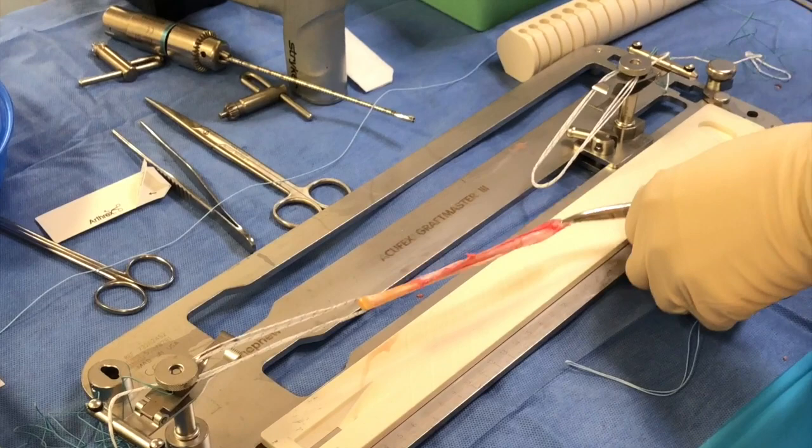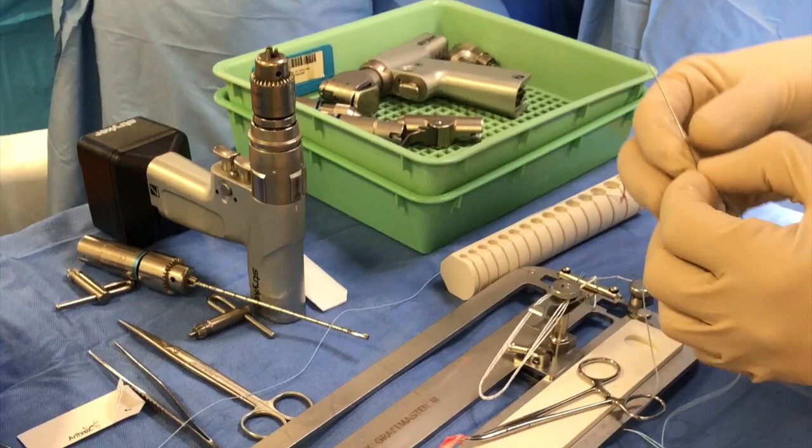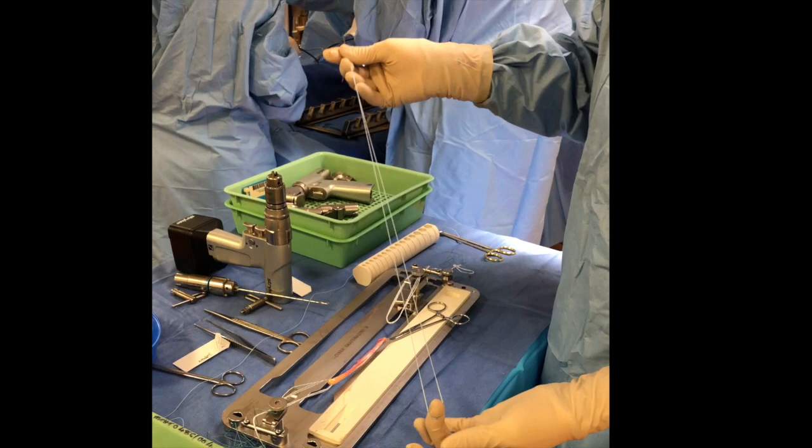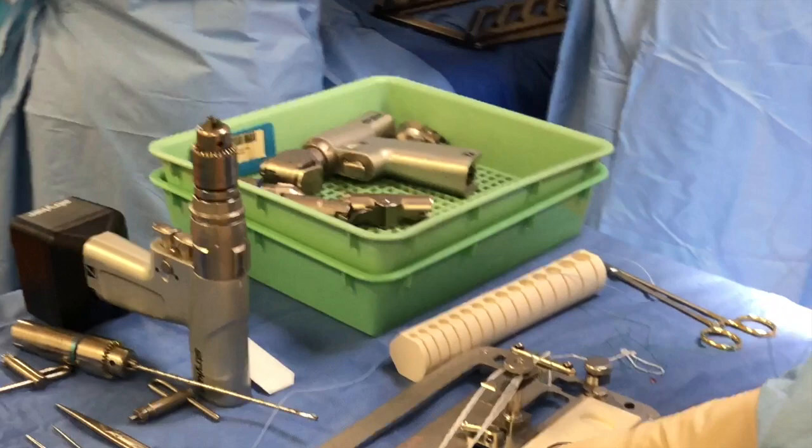We fold the graft in half and there are various ways of fixing the graft. We can do a simple whip stitch of the lower end, or in this case we're using a fiber loop — it's quicker and actually wraps the graft into a more cylindrical shape as opposed to a flat graft. The first step is that the thickest portion of the fiber loop is fed through to the needle so that the thinnest portions are at the head of the needle.